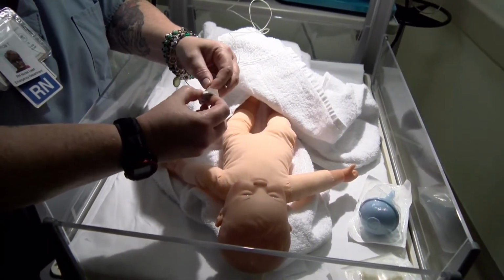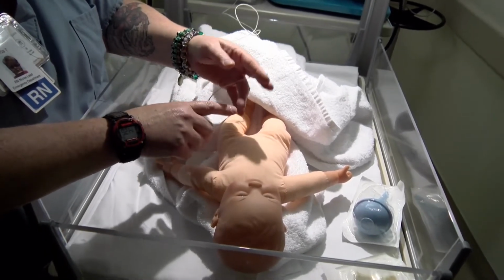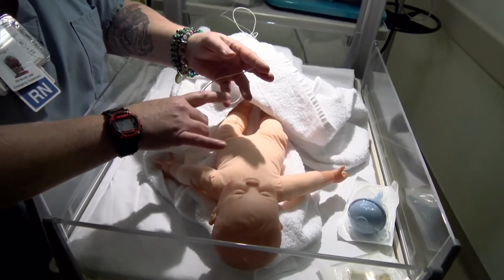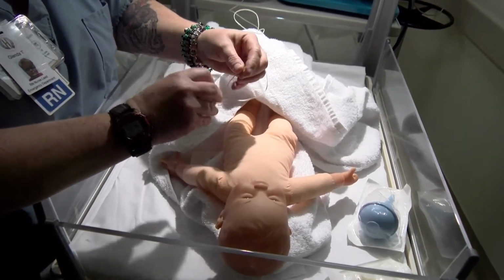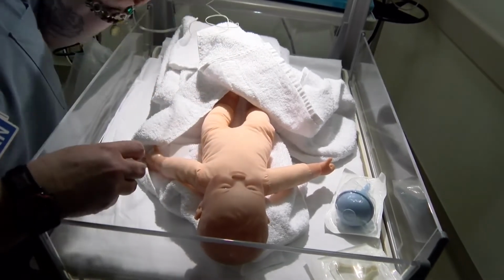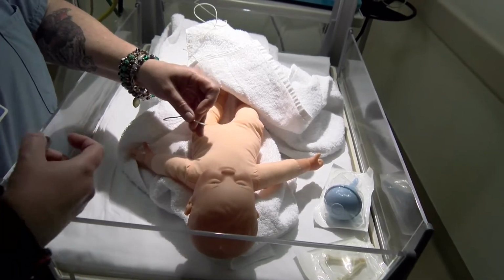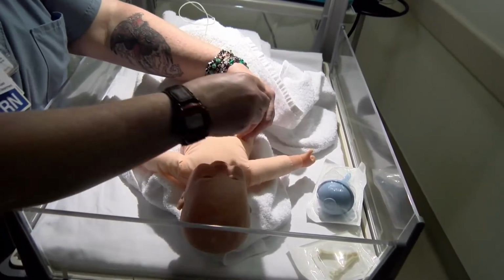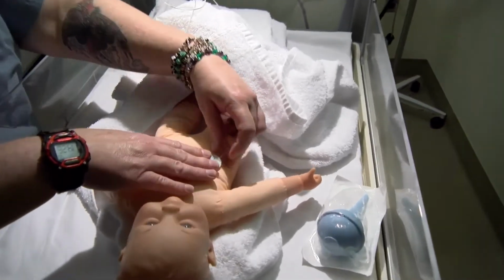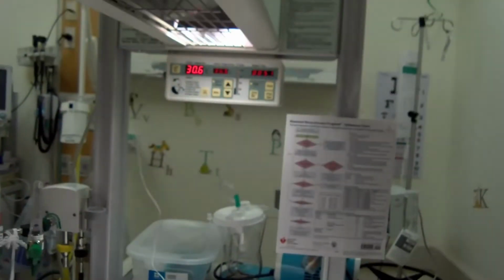Those are numbered from a scale of 0 to 2. A perfect score on the baby is a 10. Average babies are usually anywhere from 7 to 10. Anything below 7 you're going to want to consider possibly needing resuscitation. You're going to put the probe on the infant's right upper quadrant over the liver, and you're going to tape that down, and then you're going to switch this mode to servo.